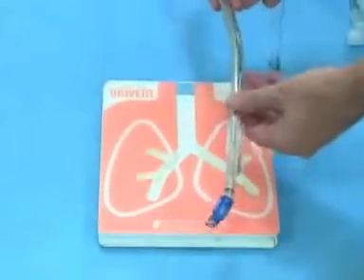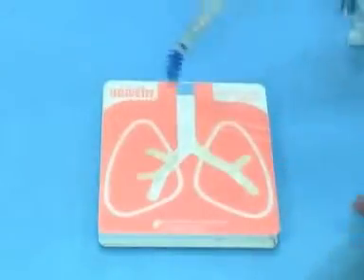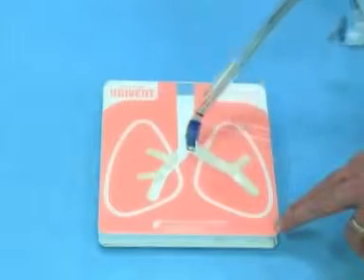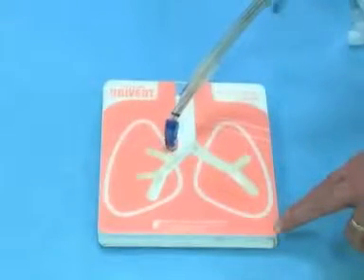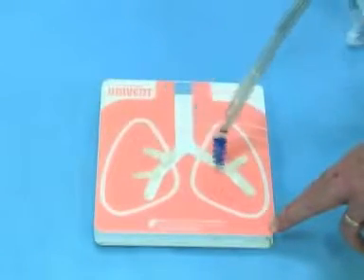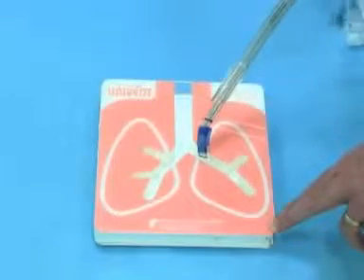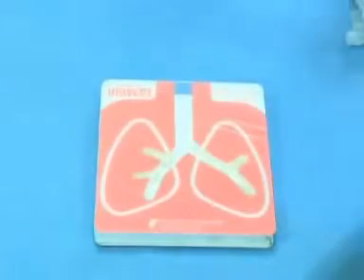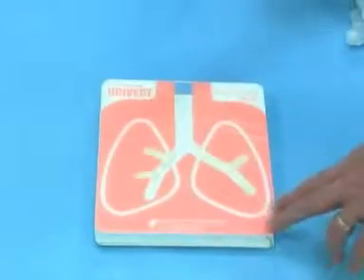First we're going to use the double lumen tube. Almost always we use a left-sided double lumen tube. The reason for that is there's a lot of length down the left main stem, but very little length in the right main stem before the right upper lobe take-off, so that can be a problem. Generally we encourage people to use a left-sided tube. Right-sided is for more specialized circumstances, such as a left pneumonectomy.